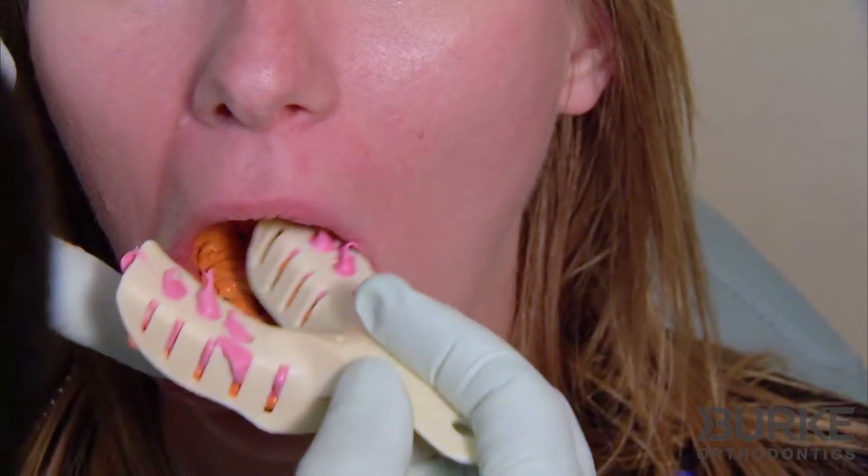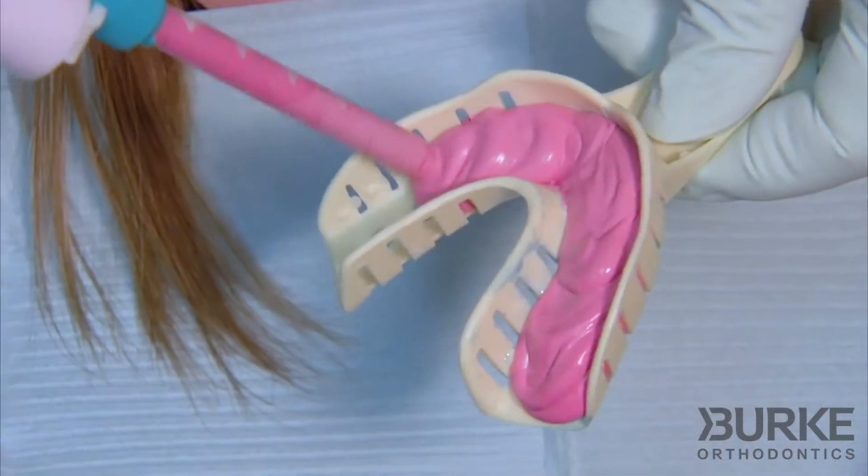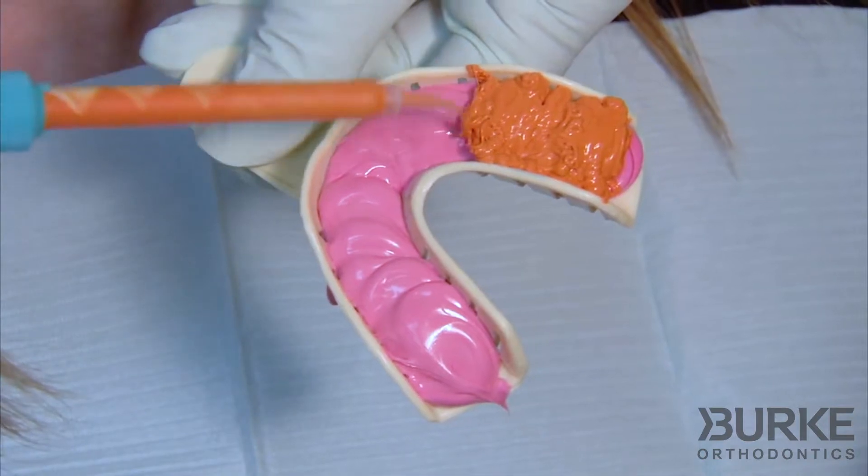A good impression ensures a good fit, but the hard thing about impressions is that the impression putty can make us gag and can be very uncomfortable. The good news is that impressions as they have traditionally been used — with goopy, slimy, nasty impression putty — are history.